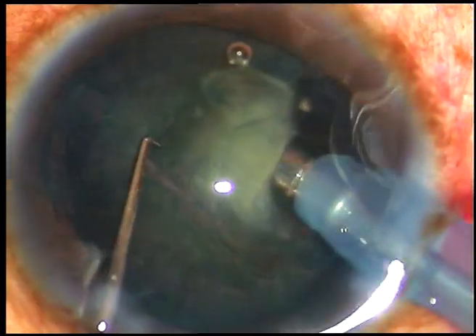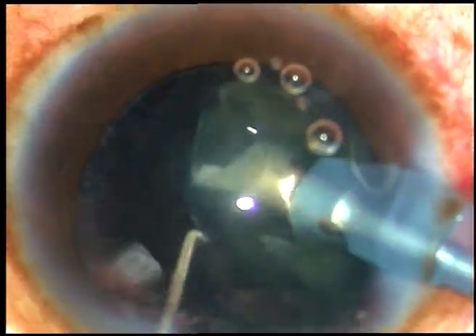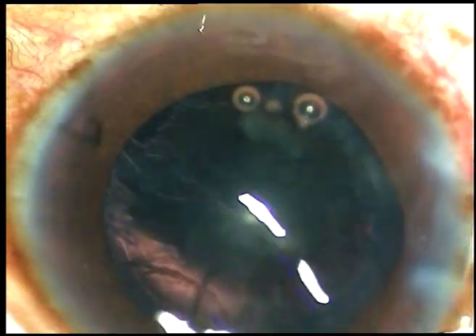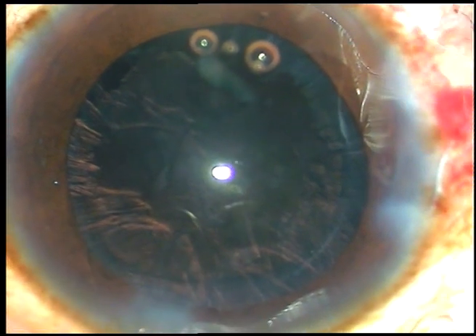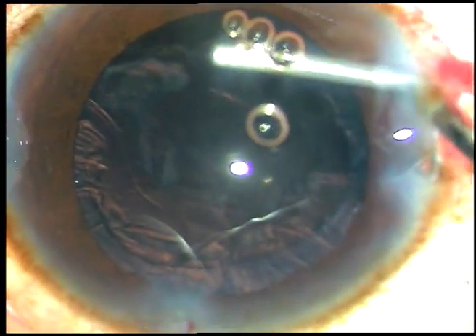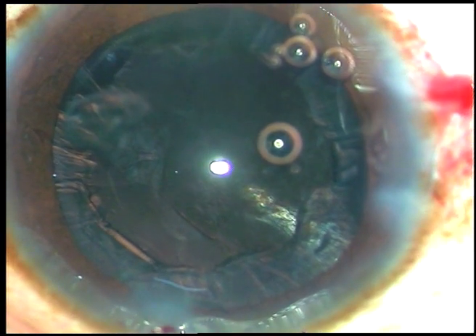Followability of nuclear pieces can be increased by turning the bevel towards the nuclear mass. Nucleus is managed. Now a little bit of viscoelastic substance is injected into the anterior chamber. This is a piece of epinucleus which is sticking to the corneal endothelium.